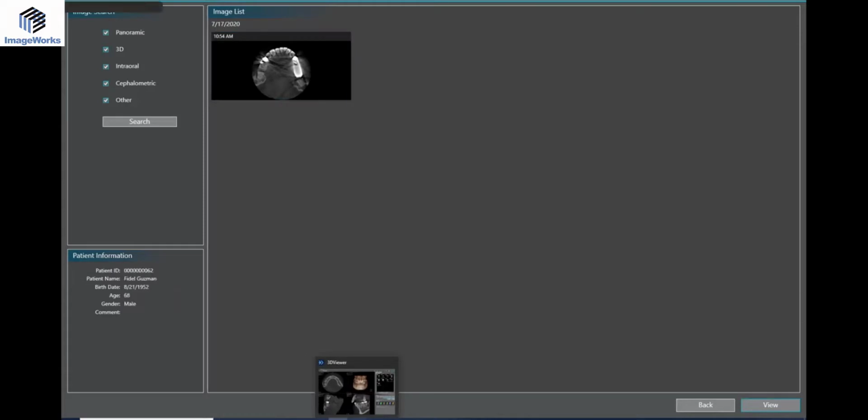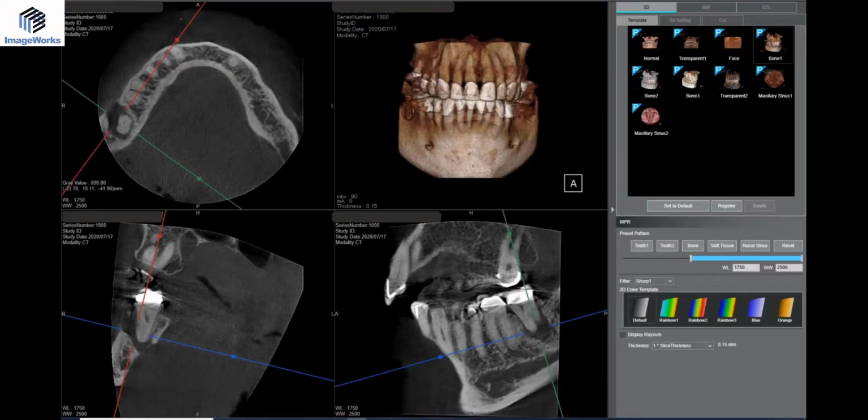This is the tooth here, and wow, this is the one that's gone. There's the buccal, drag this through, and you can see the infection all the way through to the lingual. So it's all the way through, back and forth, both sides. And this is how it looks on this side over here. And the 2D picture didn't show this at all. Yeah, that's amazing. This is major.